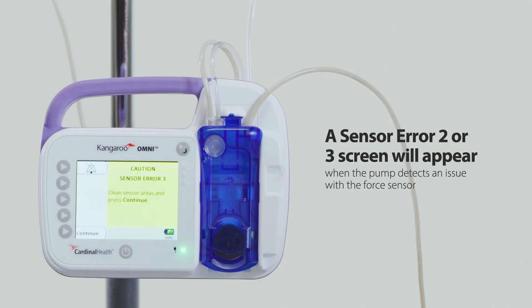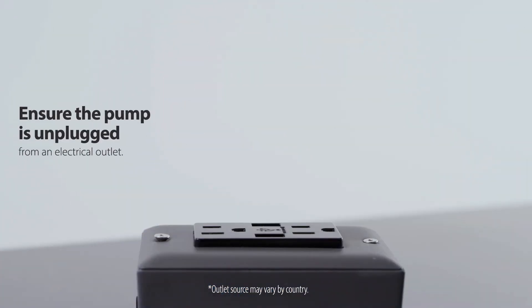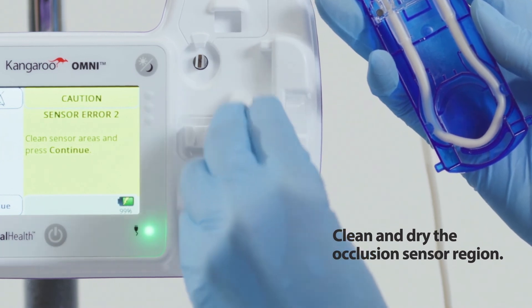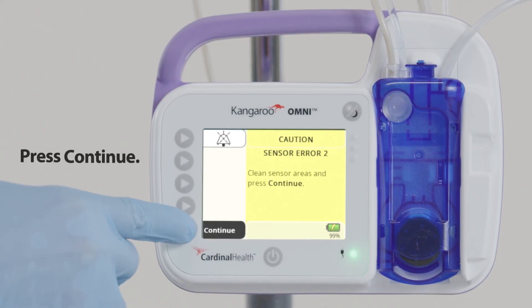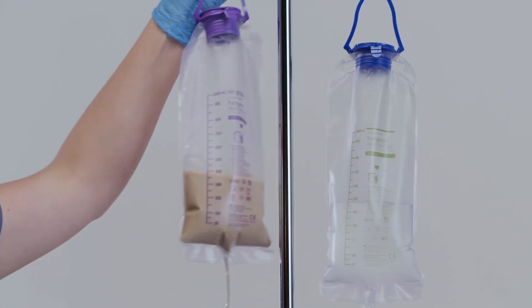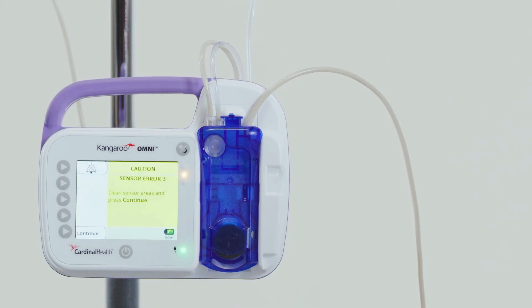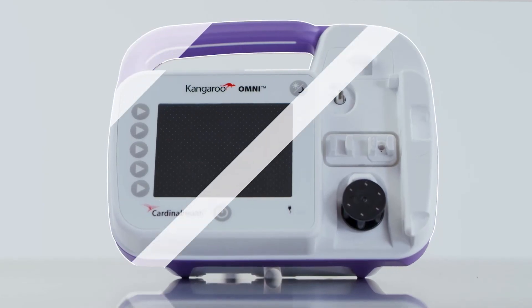Sensor error two or three alarm: a sensor error two or three screen will appear when the Kangaroo Omni enteral feeding pump detects an issue with the force sensor. To resolve the alarm: first, unplug the pump from the electrical outlet. Second, remove the cassette. Third, clean and dry the occlusion sensor region. Fourth, reload the cassette. Fifth, press continue. Sixth, restart feeding. If the alarm continues, replace the feeding set. If it still continues after replacing the feeding set, press power off and use a different Kangaroo Omni enteral feeding pump.